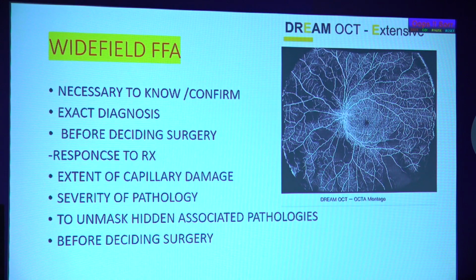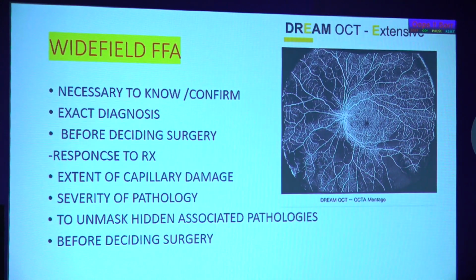Extent of capillary damage and the severity of the pathology, we can get an idea of before starting the treatment itself. So the counseling of the patients and planning of the treatment is very much possible before starting. And most of the time, there are some hidden pathologies where you were thinking of something and you come across a different diagnosis. So it is very important before deciding the surgery and treatment.